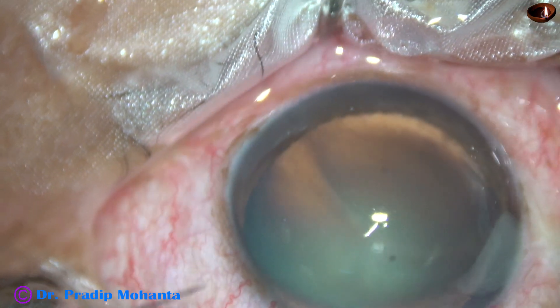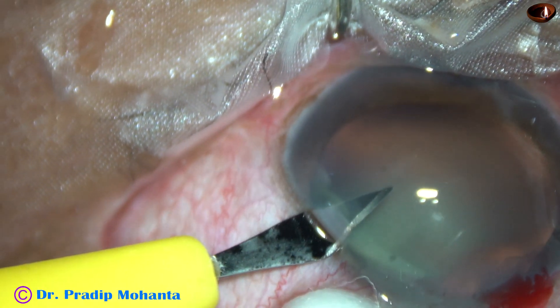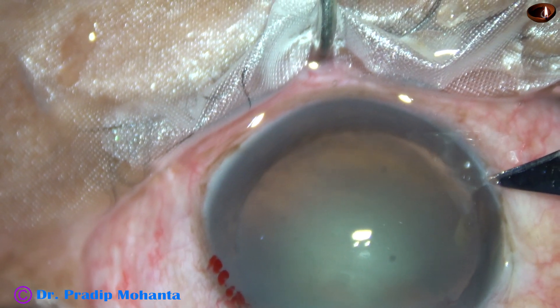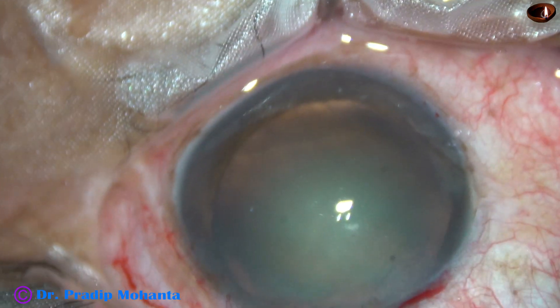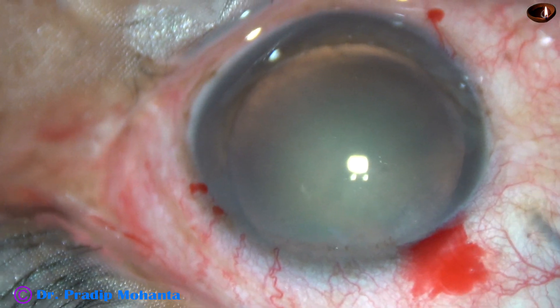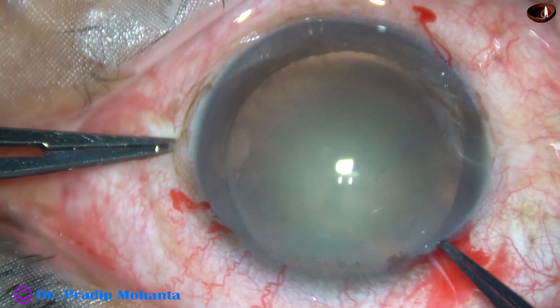And now, side ports. There is one side port on the left side of the main incision, and another on the right side of the main incision. These side ports are about 3 clock hours away from the main incision, and their width is 1.2 mm.